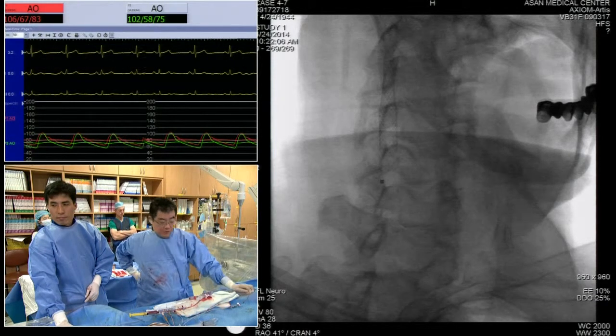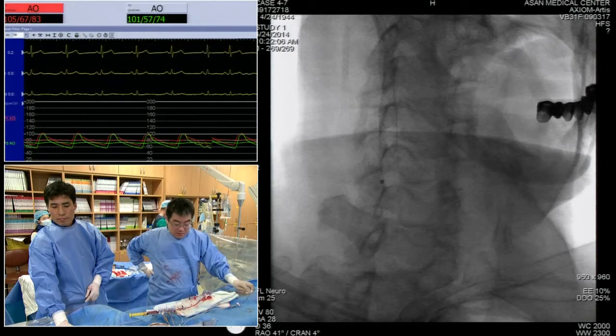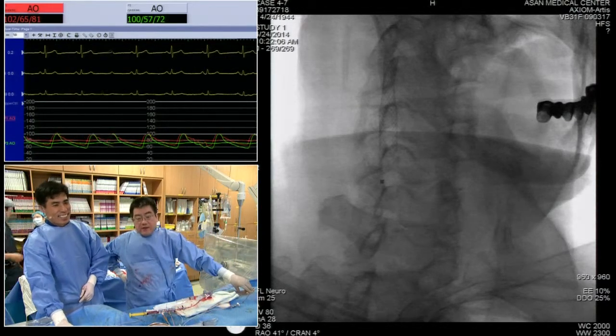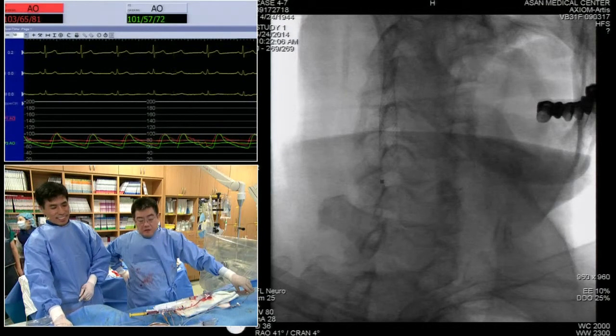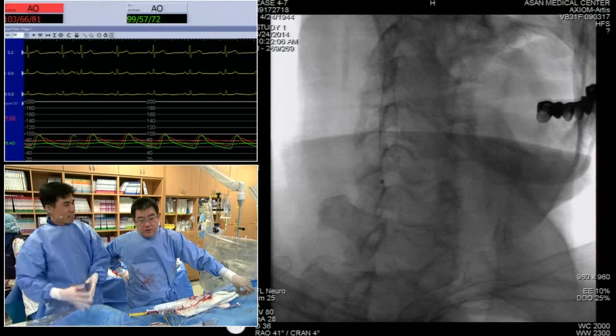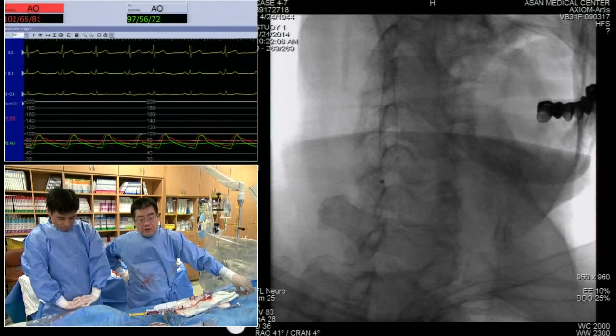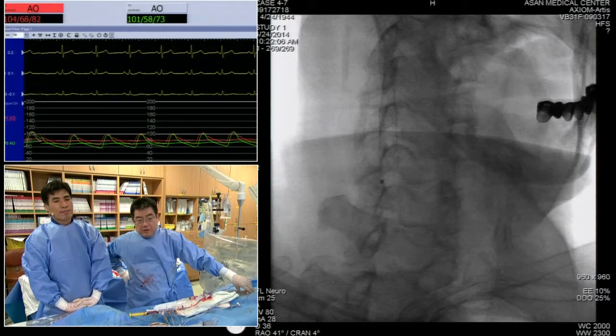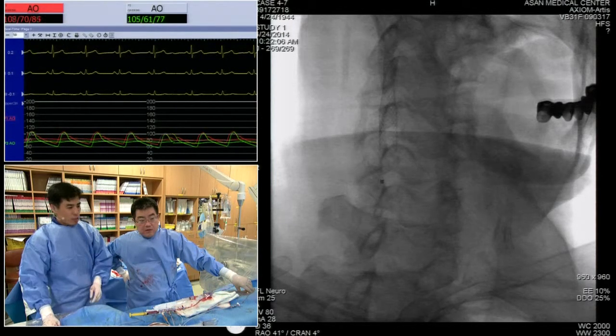And does carotid stenting have a bad effect on the aneurysm? In theory, that is possible, expansion of the aneurysm. But for those cases, usually we will sedate the patient and control the blood pressure very carefully, keeping the blood pressure as low as possible. Check the final angiogram.